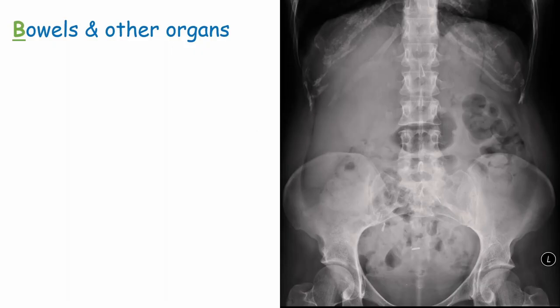As part of B in our mnemonic, we also need to check other organs. These are mostly tricky to see, but it's important to attempt to identify them to rule out any obvious abnormalities such as organomegaly.